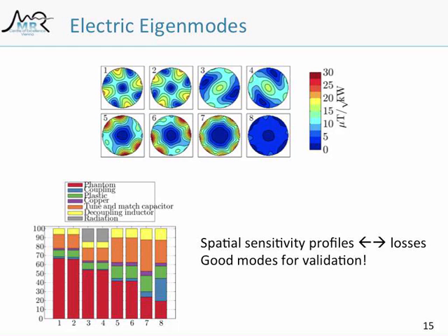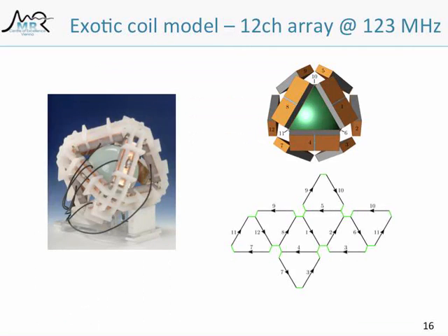But moving on, let's say you have a nice new idea for a coil which you want to try out. For example, something like this. That was a coil I had in Berlin. I didn't build it, but someone else did. So that's a funny coil, that's the edges of an octahedron, and there you've got those current sheet antennas, and that has got a funny geometry around. So how do we understand this coil?